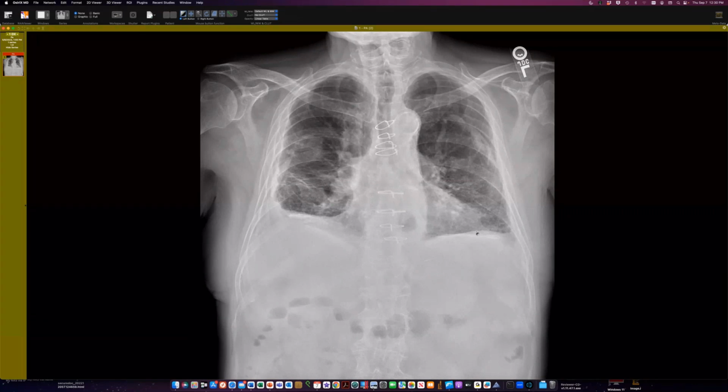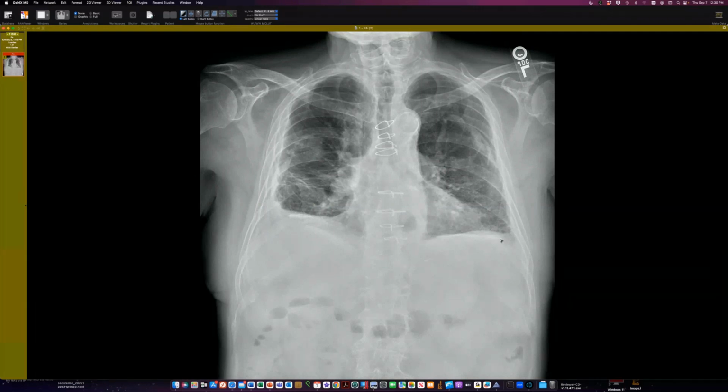And then I'm presuming that this is plaque calcification down here. It's got that look of plaque rather than diffuse pleural thickening kind of calcification, which tends to be more irregular and variable in thickness. This is pretty discrete, and I think that fits well for ordinary plaque. So this person has plaque and diffuse pleural thickening, has low lung volume, partly because of restriction from diffuse pleural thickening.